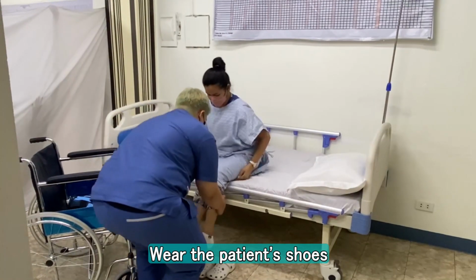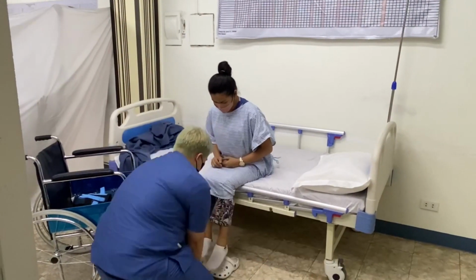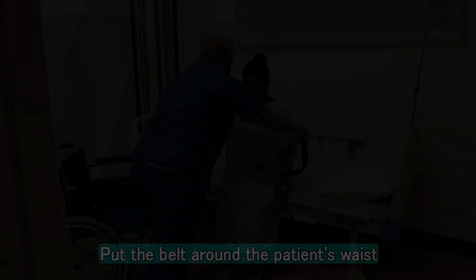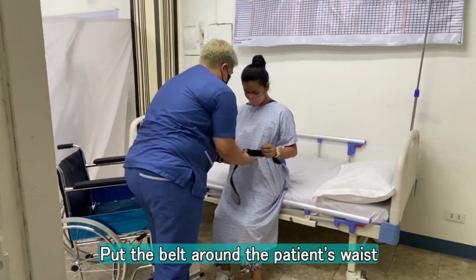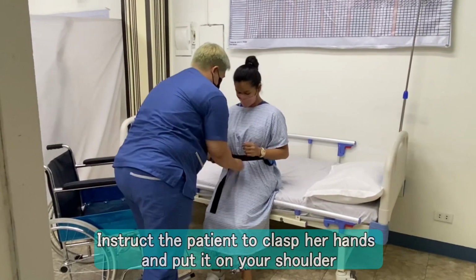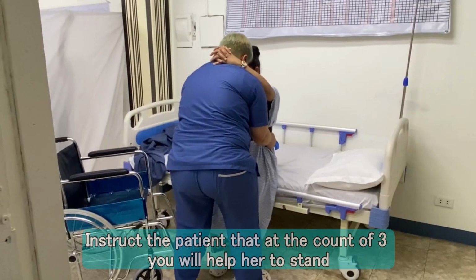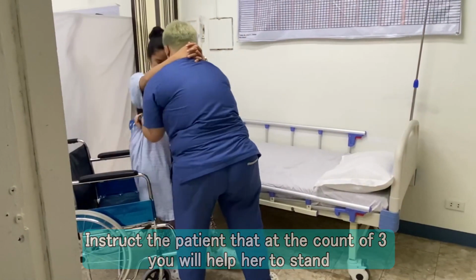Wear the patient's shoes. Put the belt around the patient's waist. Instruct the patient to clasp her hands and put them on your shoulder. Instruct the patient that at the count of 3 you will help her to stand.